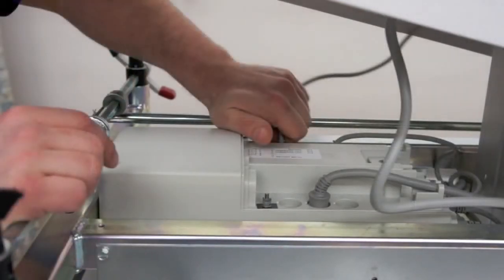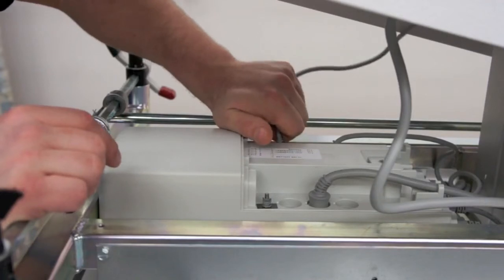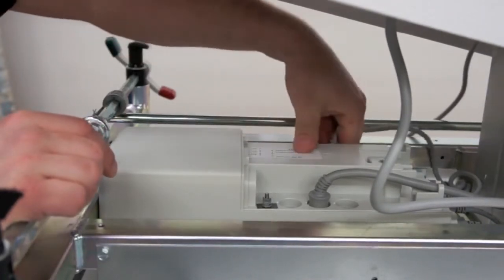Before removing wires, be sure to label each one. This will make placement easier. Remove the wires and place off to the side.